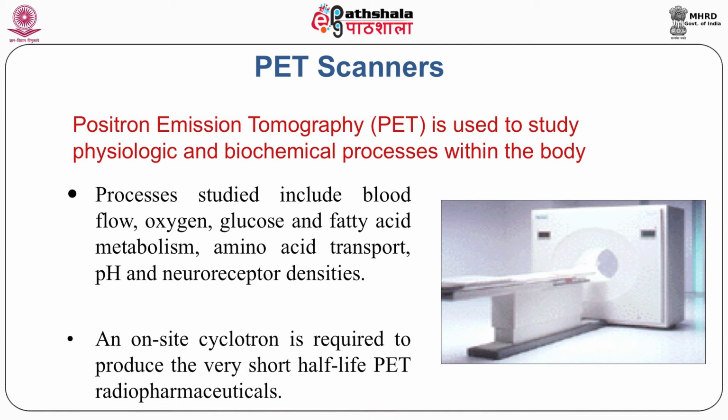The PET scanner is nothing but again new era technology where we use radioisotopes for molecular purposes, and you are not limited to the organ level, you can get to know about the disease at the cellular level, or find abnormalities. So it is called positron emission tomography.